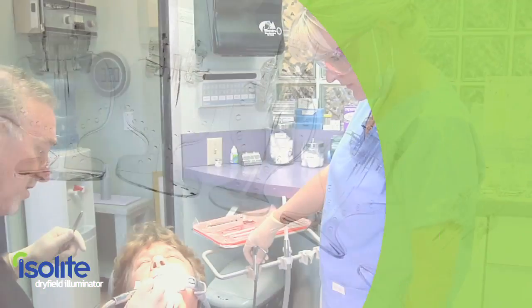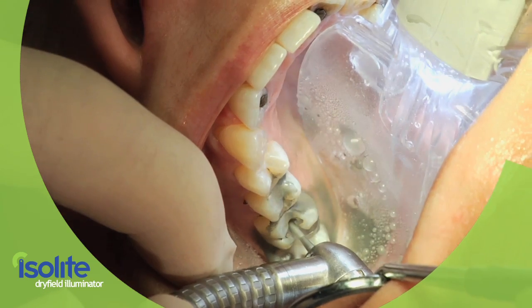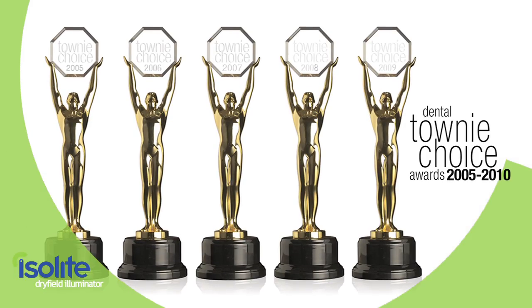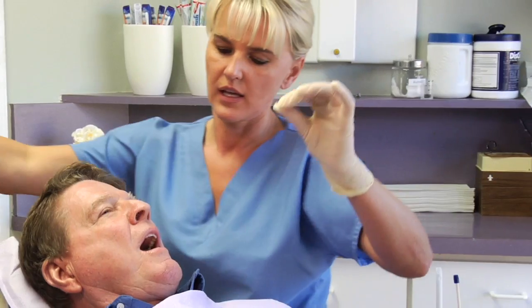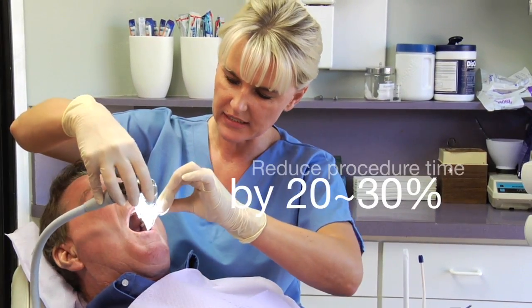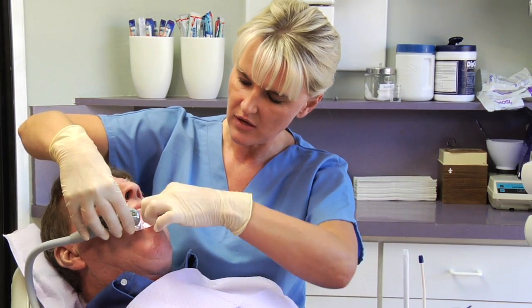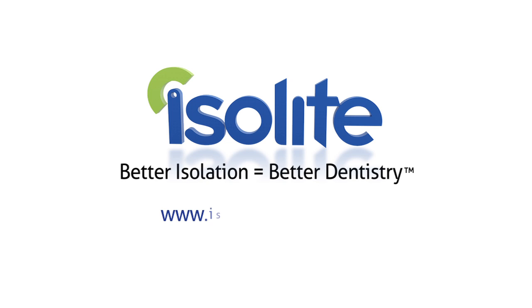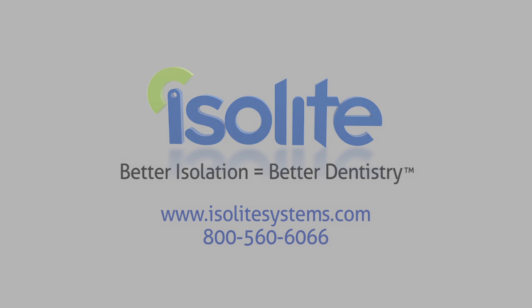This paradigm shift in isolation, combined with an ergonomic design that reduces fatigue and repetitive stress associated with retraction, suctioning, or otherwise repositioning the patient, has resulted in several industry accolades since Isolite was launched. Dentists using Isolite are reducing procedure times by 20 to 30 percent, making the entire practice more productive and profitable.